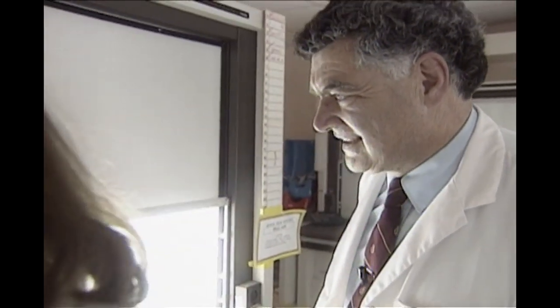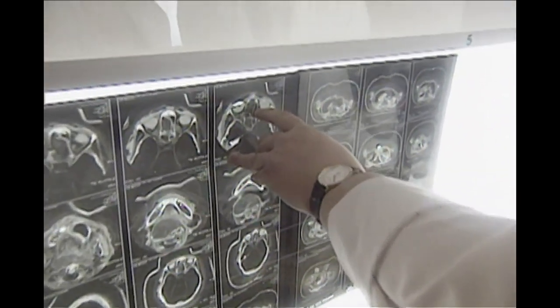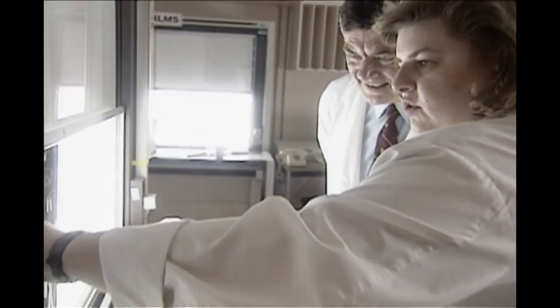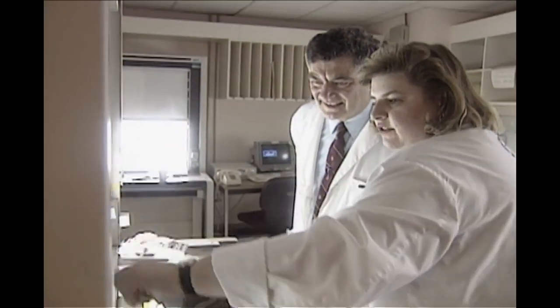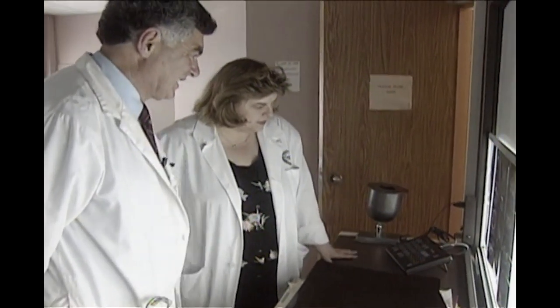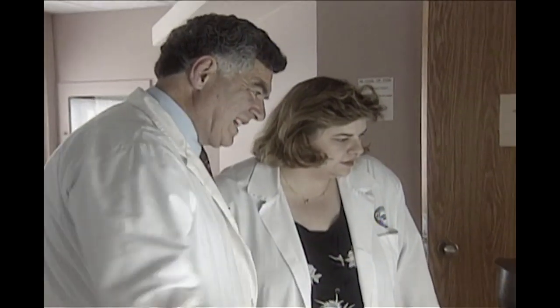Lewin examined the 3D image of Jed's skull. He noticed a strange black shape on the left jawbone. The gaping hole, he realized, was an enormous abscess. Hard as it is to believe, Jed had died from dental disease. Ancient Egyptians were prone to dental disease because of their sandy, coarse diet and their love for sweets.